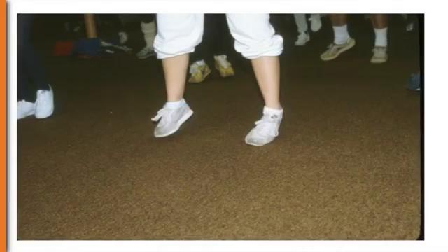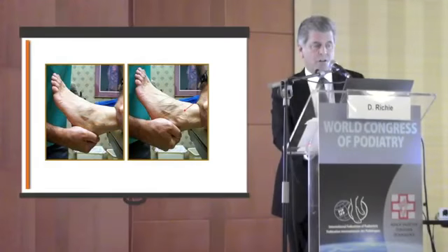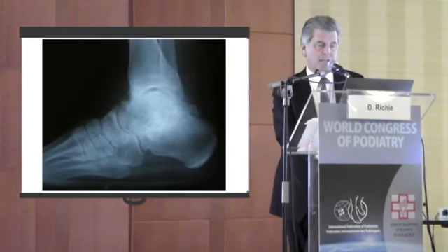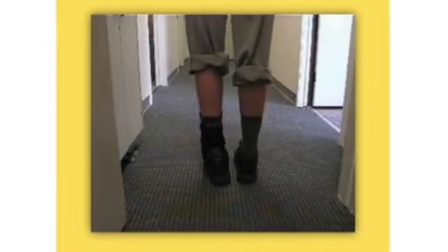His solution from the surgeons is to fuse his ankle, and that's the only solution viable, other than bracing. We made him a brace that unloaded or offloaded the medial or lateral aspect of his ankle, and even though he still looks somewhat inverted here, when we decompress the ankle joint with offloading bracing, we get rid of pain. And this can again be very gratifying.